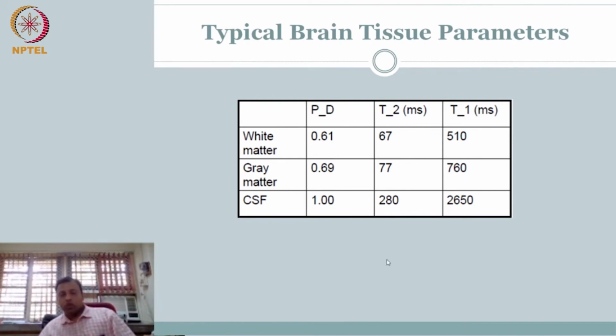So now the objective is, how do I get an image where I can see contrast predominantly due to, because the material is the same, it's going to be brain which is going to have three materials. The contrast is going to be mainly due to differences in proton density, or differences mainly due to T2 or T1. Notice this material is undergoing PD, T2, T1, all happening simultaneously. Okay, so now the objective is, how do I get an image that predominantly captures the difference here, or the contrast due to proton density, contrast due to T2, contrast due to T1.